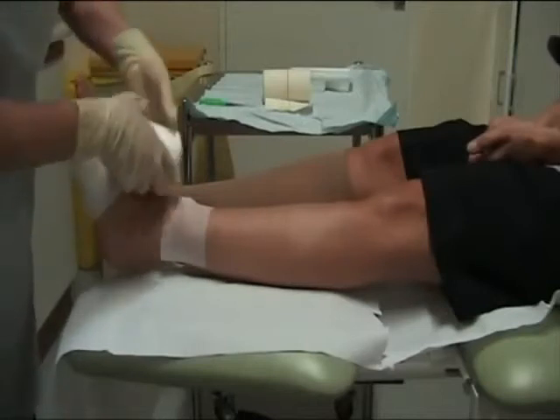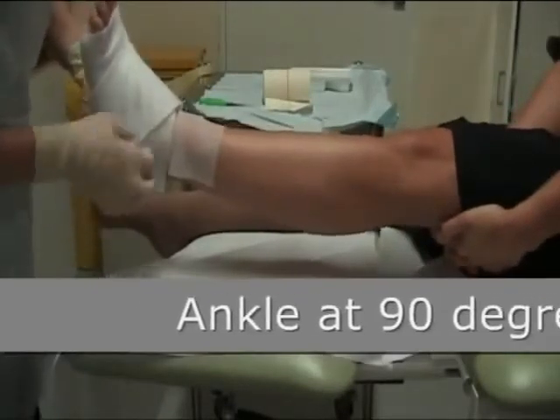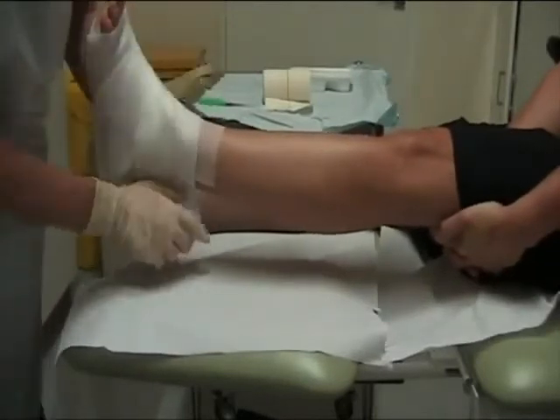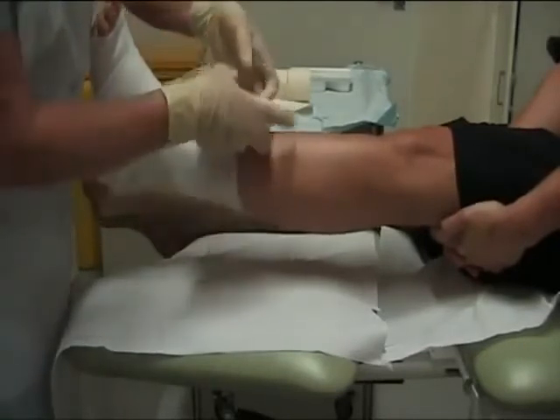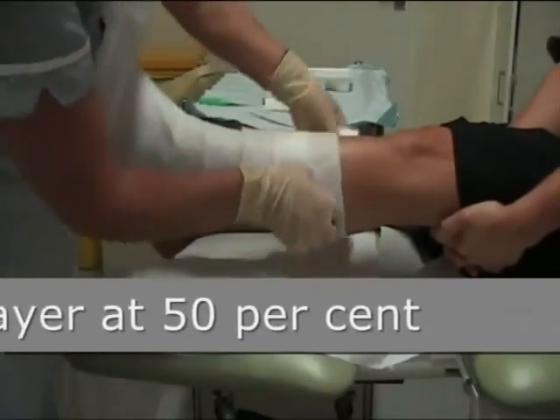The ankle is held at a 90-degree angle to apply the bandage. This is then applied up the limb, covering each layer by 50% at each turn, up to the knee.